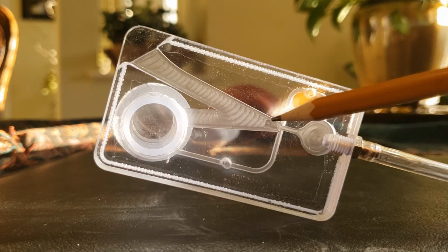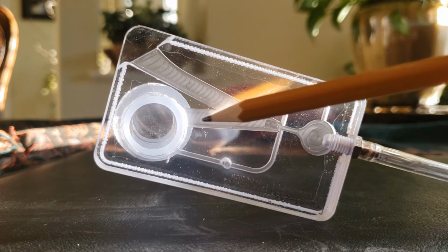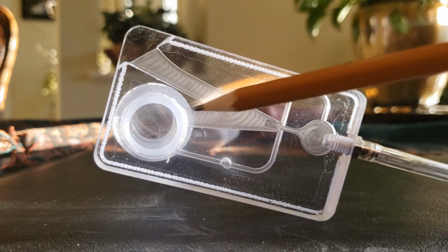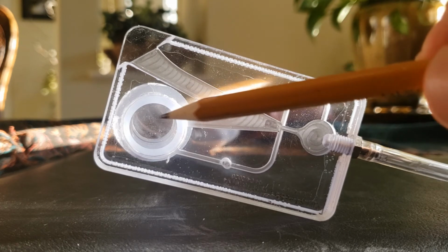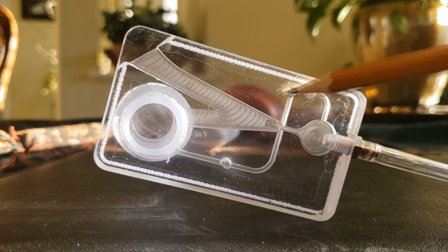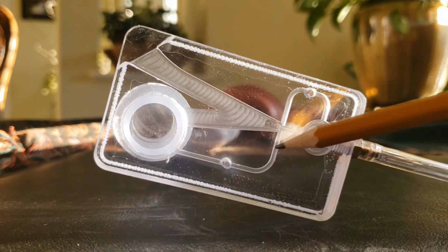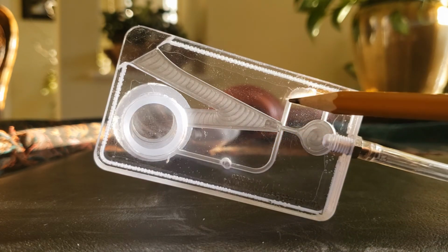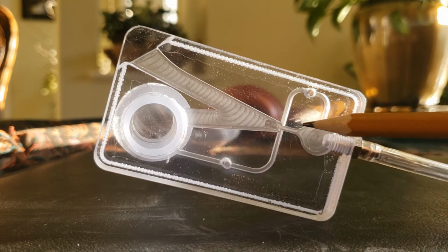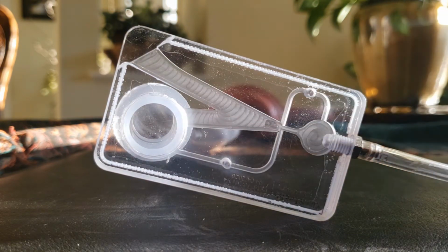As the high pressure air shoots out the exhalation channel, the air in the lungs is sucked out, and eventually it reaches a low enough pressure that the difference between this high pressure side and this now low pressure side creates a flow from the right to the left, pushing the high pressure stream back to the lungs and restarting the cycle.